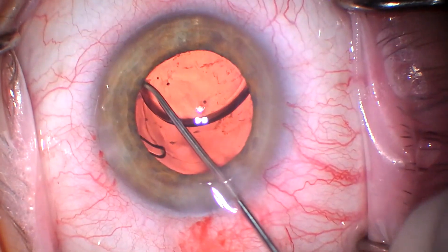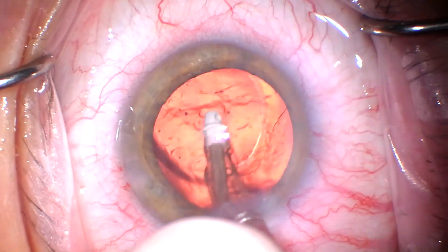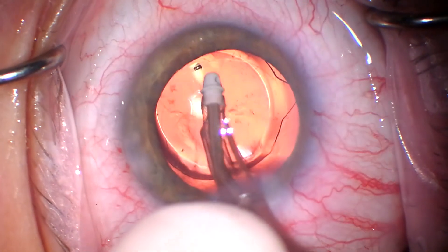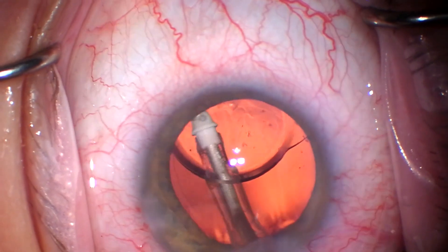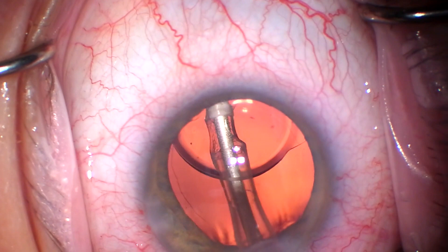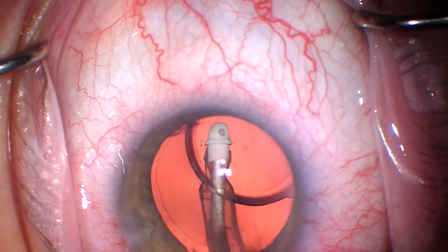This is an AMO/J&J ZCB00, which is really just an excellent lens. By the way, I have no financial interest whatsoever in any of the materials used or discussed here. I'm going underneath the lens to remove viscoelastic.